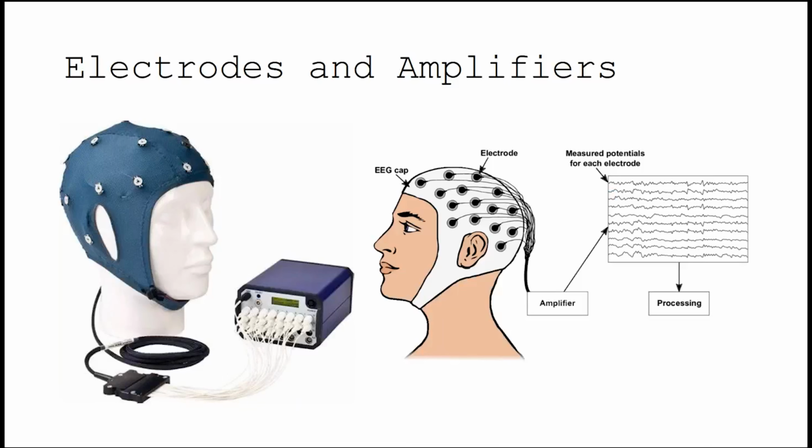So first, the amplifiers. This is a very basic picture, but maybe you can visualize how an EEG is recorded. The first thing, which you actually know, is that there are electrodes placed on the scalp. This is what I showed you last time. Those electrodes always measure some kind of differential of the potentials occurring from the neuronal activity. And here you can see an example.